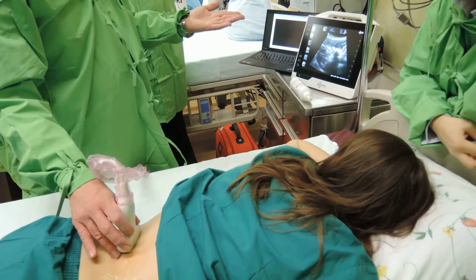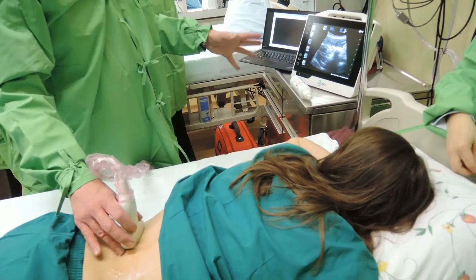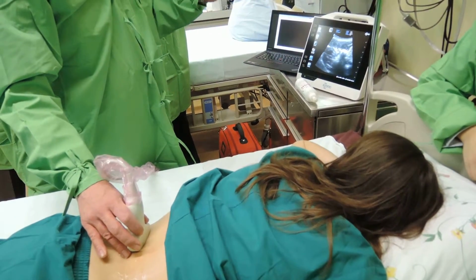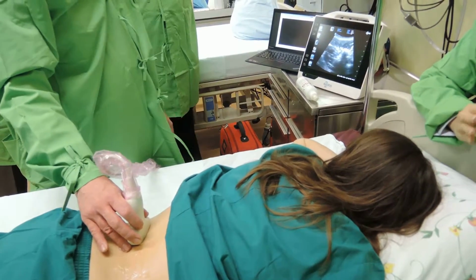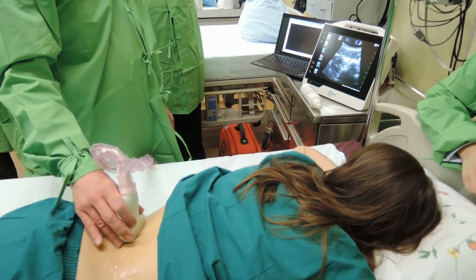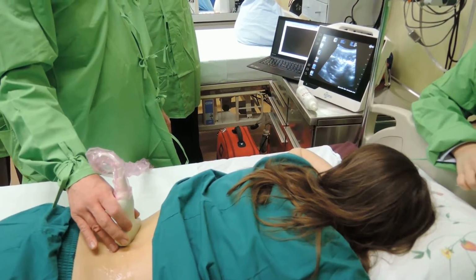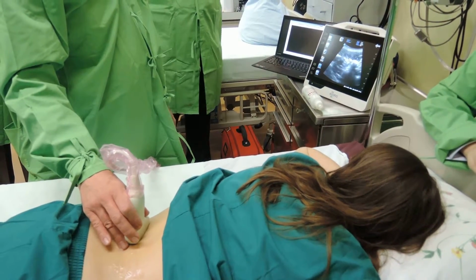You won't see the root, what you see in any case are the bony structures that help you to have an idea where your target is, and the nerve stimulator will do the rest.